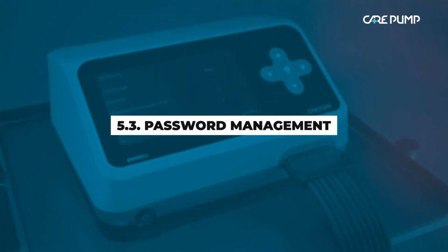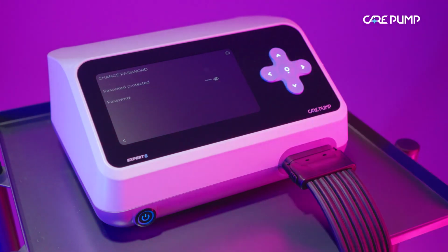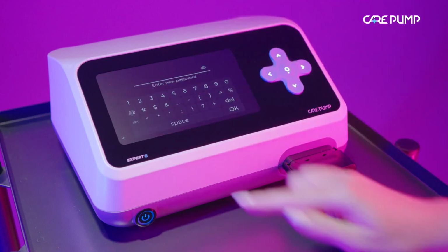Password management. Password management function allows you to set, change, and disable a password that protects the device against unauthorized users. To enable password protection, touch the button next to Password Management icon. Select Password Protected option and set it using the keyboard that appears on the screen.